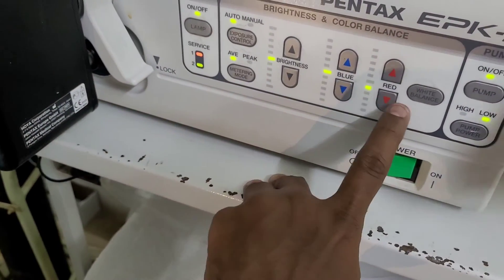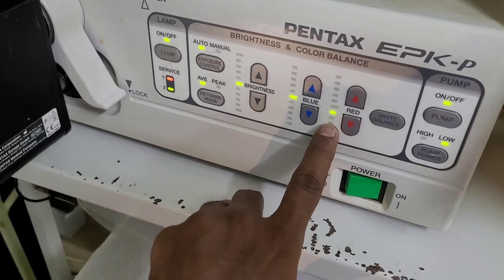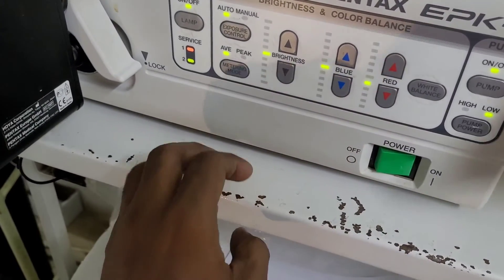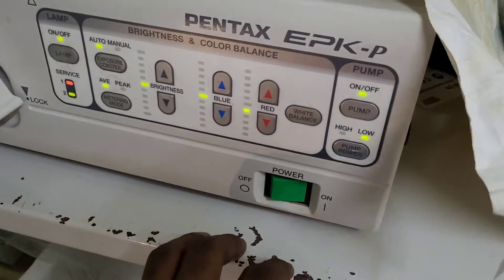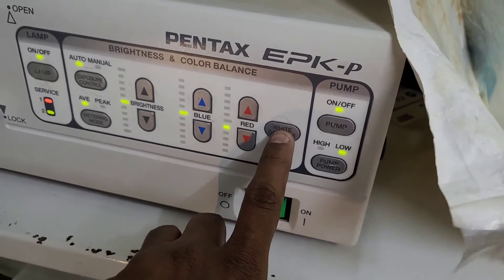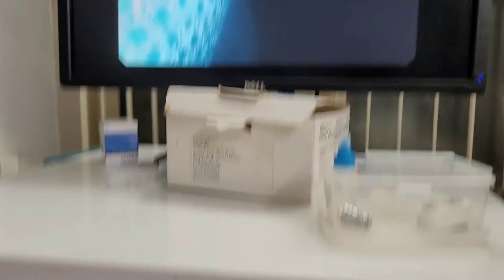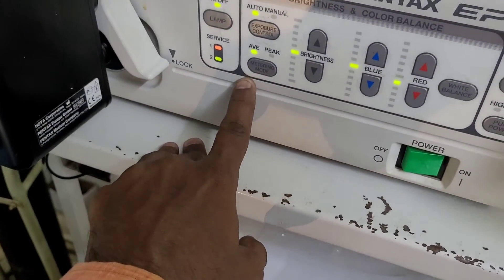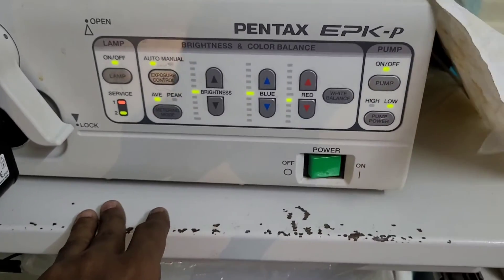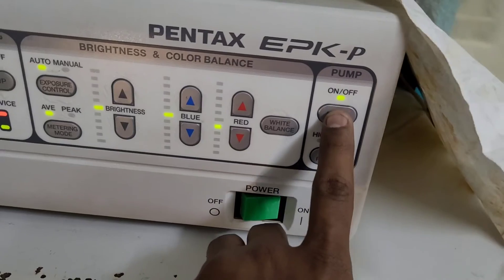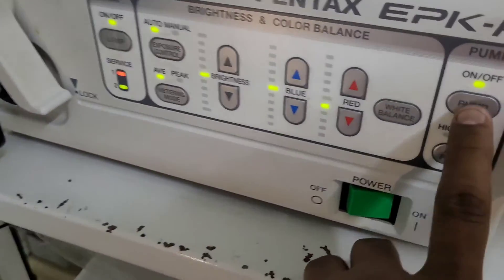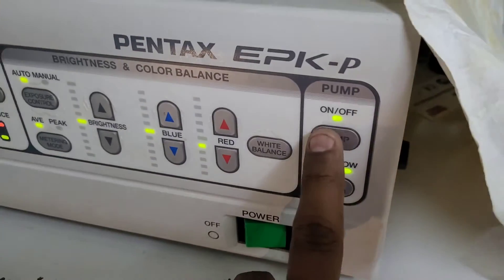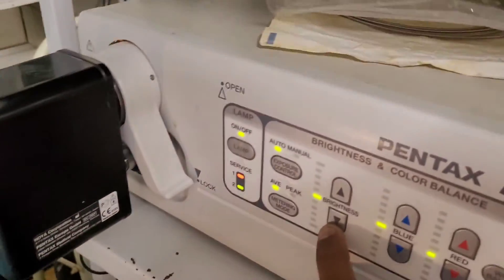Now let's look at the control unit. Here we have blue, red, and white balance settings, on/off switches, pump switches, a display, and brightness control. When you start the pump, you can irrigate the area inside.